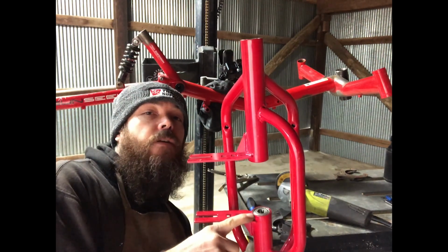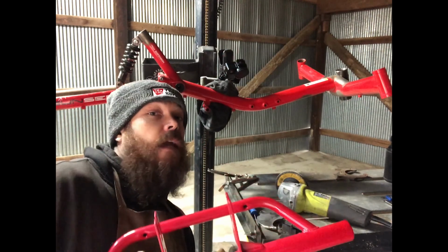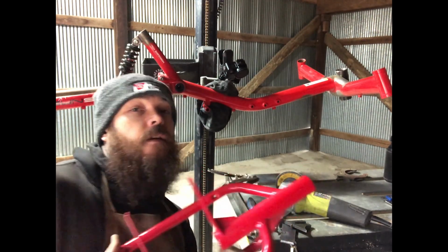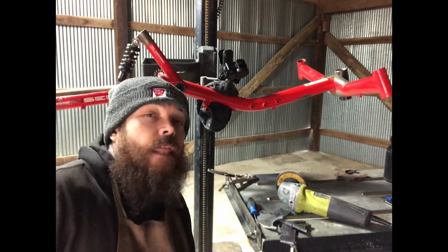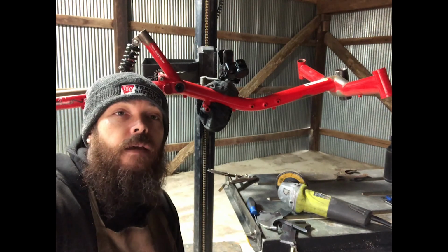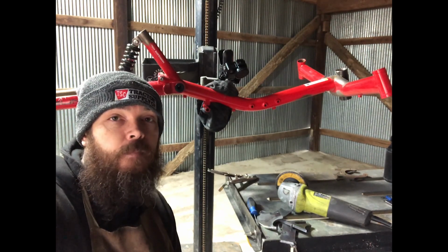disc brake mount on here already, but it's going to be on the, I would say, left side. So if you're sitting on the bike, this would be the left side. So it's my left. And that's typically where the disc brake is on. Even on your regular mountain bike, the brake will be on the left side in the rear.